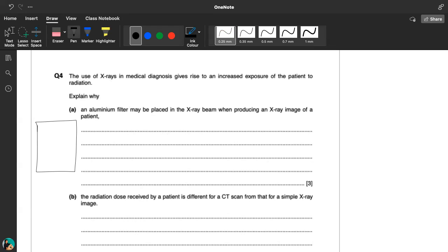This one. Okay, so you see how they take the X-ray image of a 3-dimensional. Why do you want to take a 3-dimensional X-ray? If you say like the bones, like your finger bones, we don't need to take 3D. It's just 2D is enough to analyze it, to look at the pictures.